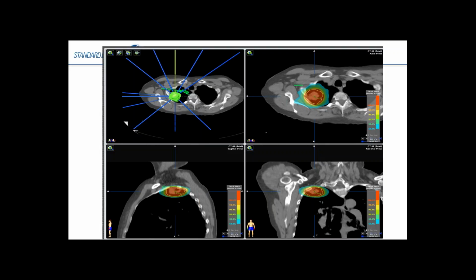We have millimeter-sized targets that require a higher level of scrutiny. And with the Lucy Phantom, we can achieve these objectives. However, it's always good to ask questions along the process and make sure you understand the results that you've obtained and whether or not they actually make sense.